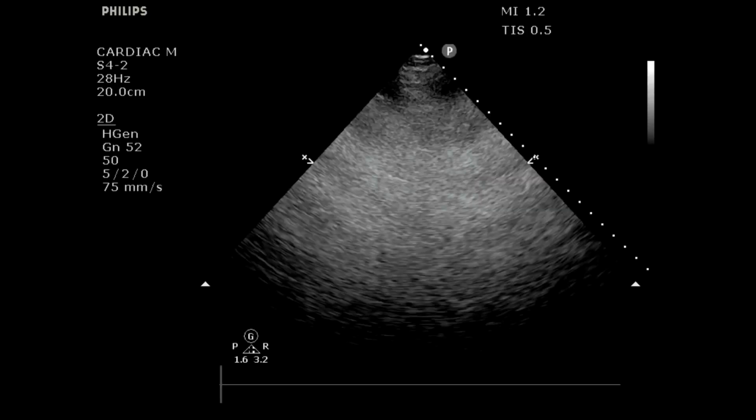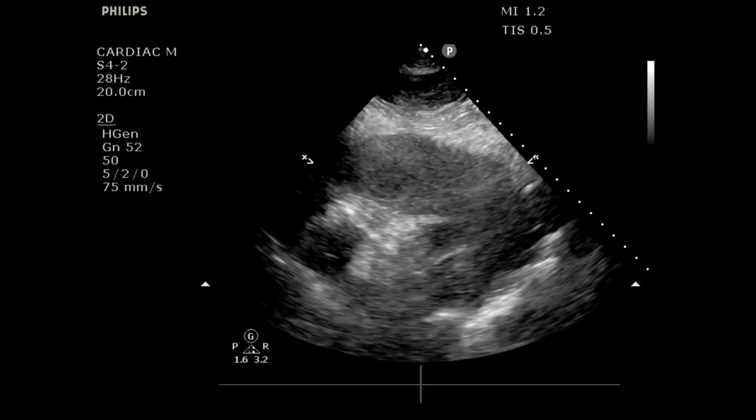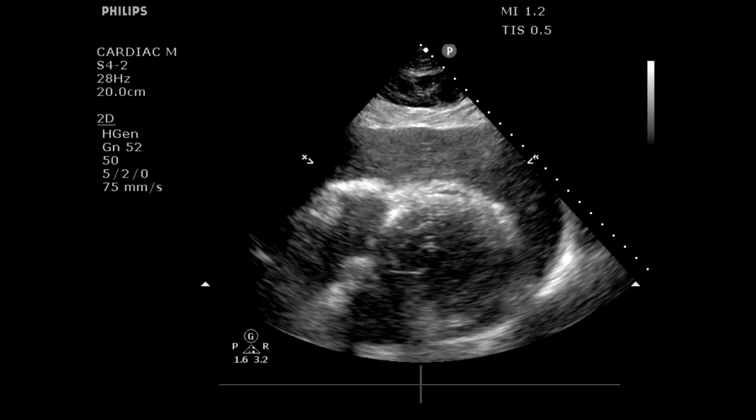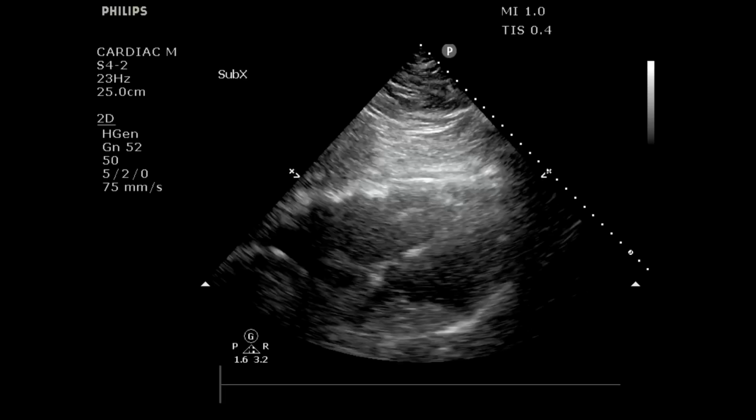Here's another case. As we look through it, let's get it started here. You can see we're finding the heart. There it is. We have a large pericardial effusion, but no cardiac activity, right? So this one had tamponade physiology and succumbed to that. That is the ultimate cause of their demise, right? There's a good article about using ultrasound to assess for activity and fluid in the setting of trauma, to see what the outcomes are, whether alive or dead, with different scenarios of fluid plus or minus activity, right?